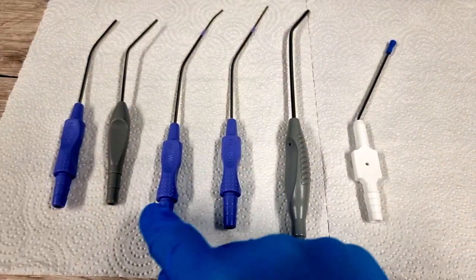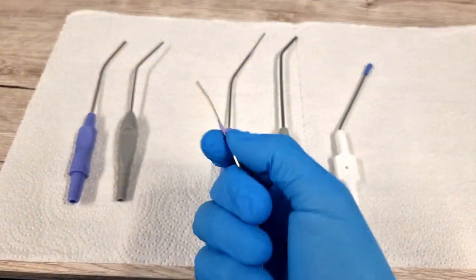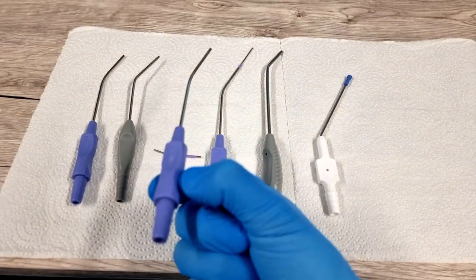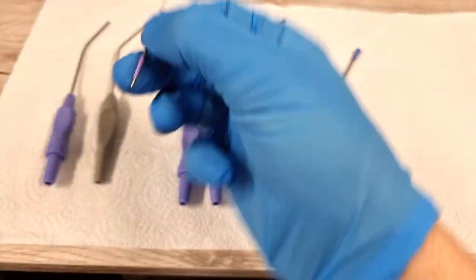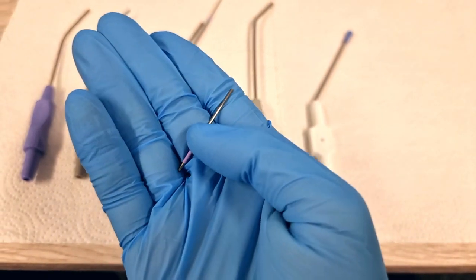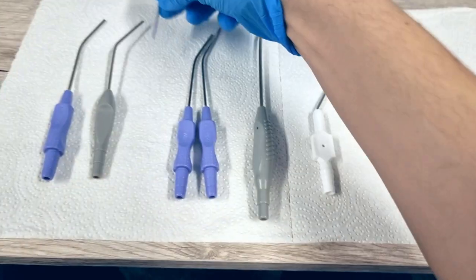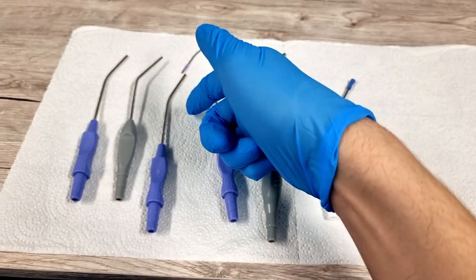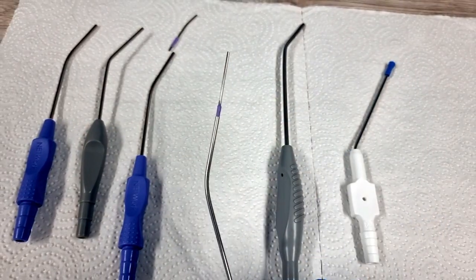Moving on. These, again, are Zollner suction probes, but with fine ends attached. You'll see here, if I can do it with one hand, there we go. So this is a regular Zollner suction probe, and you can't buy them with the fine ends attached. This little guy here is the fine end, the little attachment which you put onto the end. This one is bent, and you can't buy them bent; you have to bend them yourself. You bend it inside the packet, take it out of the packet, and then attach it as required. This is how they come, straight like that.